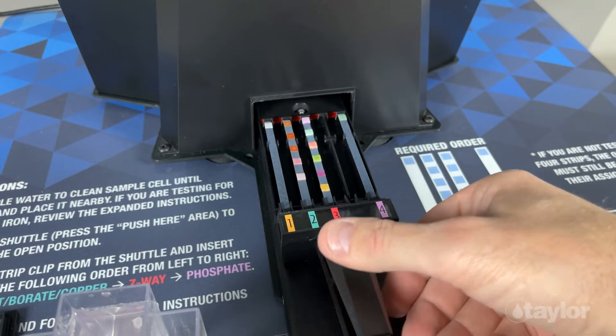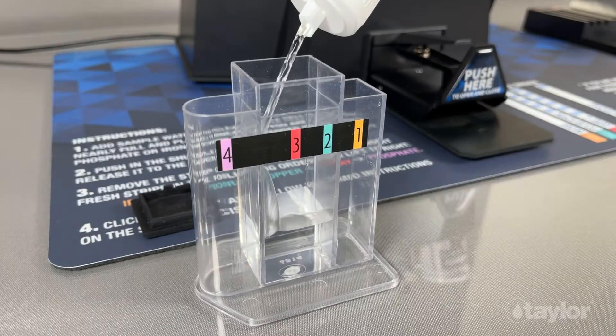If you have multiple samples to be tested, this is a great time to start the prep process for your next test.